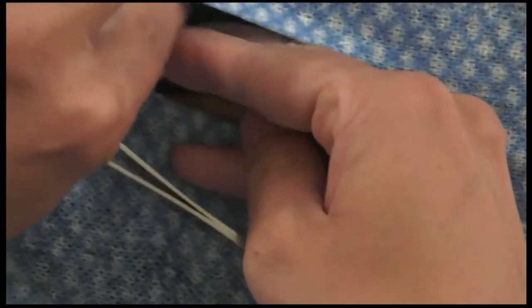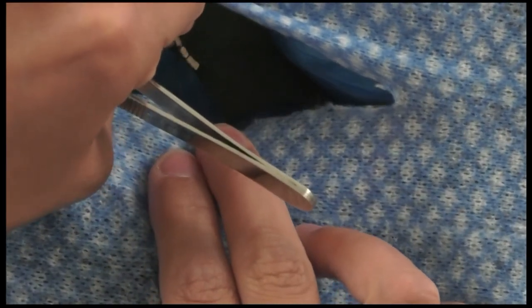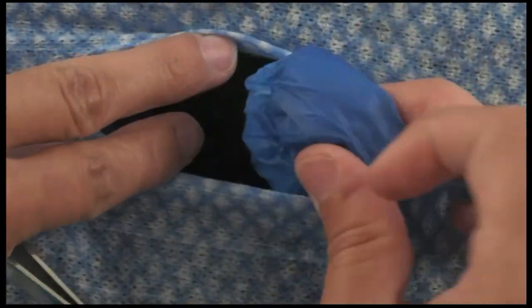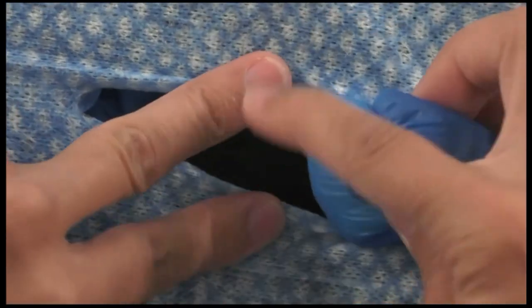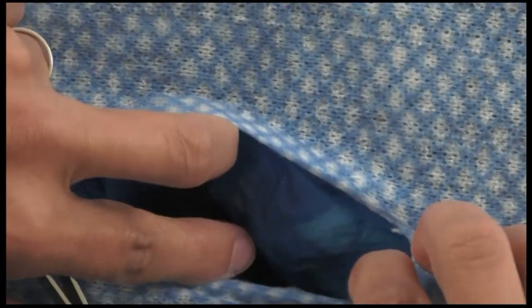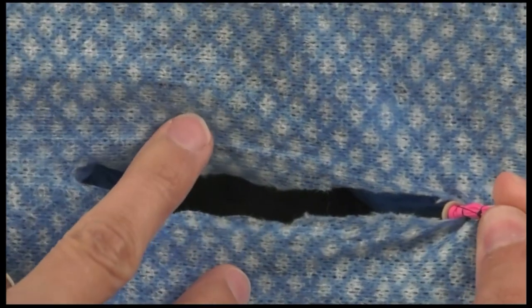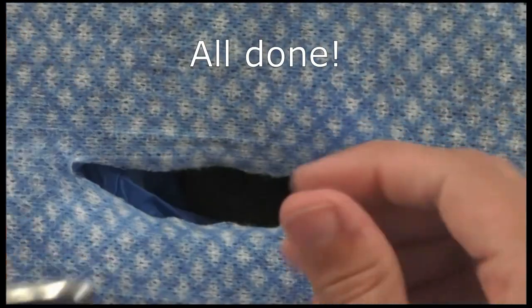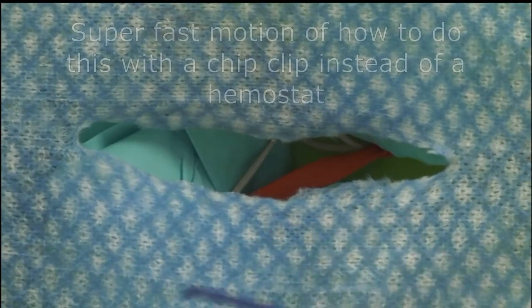I usually use my fingers to retrieve my pedicles. You want to find them on both sides — the side closest to you will be the harder one to find, but you can do it. To find the uterine stump, it's going to live under the bladder. You can retroflex the bladder out of the abdomen if that helps, or sometimes it's easier to push it aside and then grasp the structure underneath between that and the colon. Everything looks great — now you can suture and you're done.